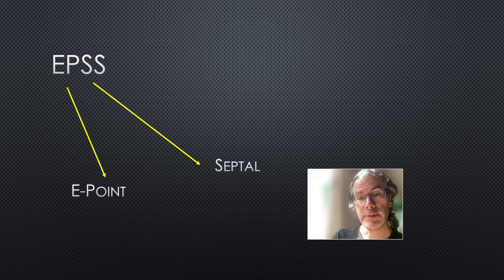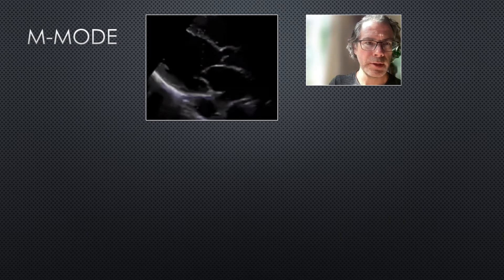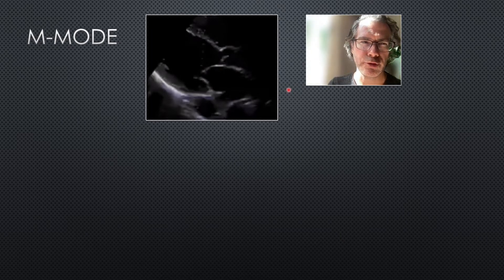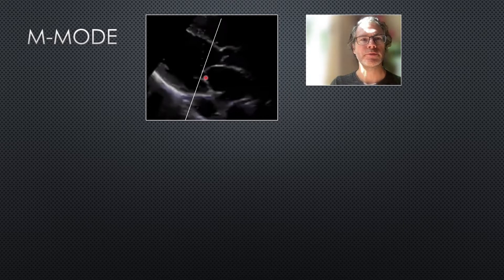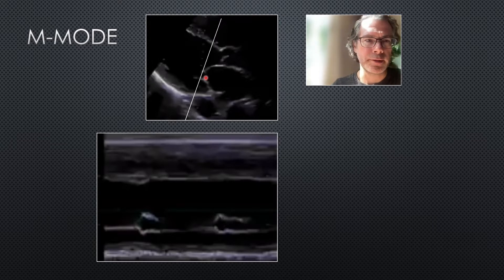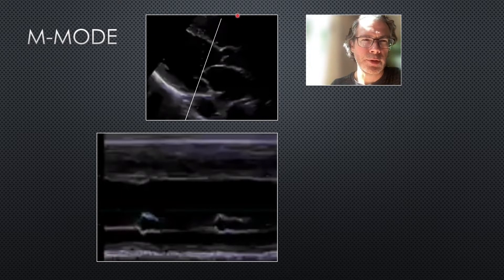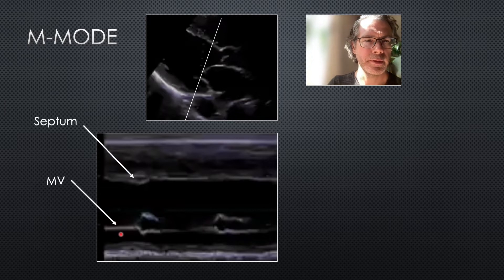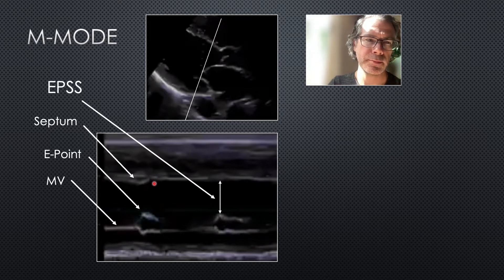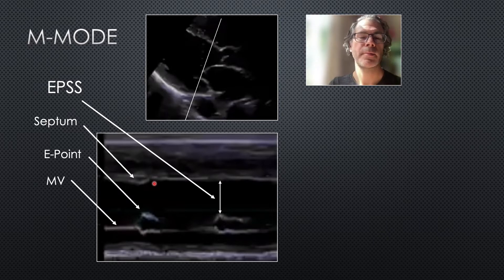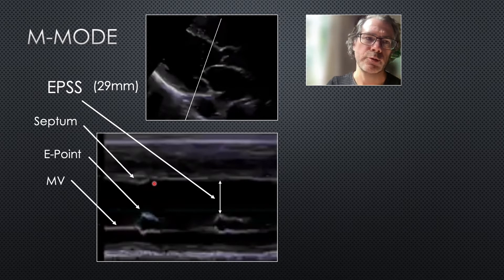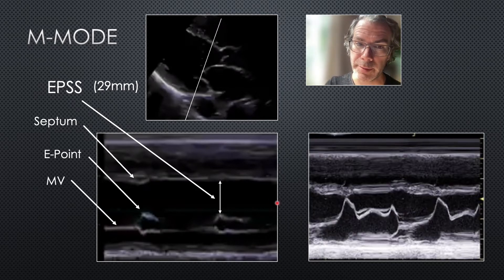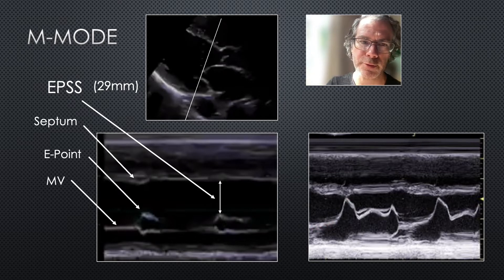EPSS stands for E-point septal separation. To measure it, get a parasternal long axis and drop your M-mode line through the tips of the mitral valve. When you activate M-mode you get a trace: all structures along the M-mode line are plotted on the y-axis against time on the x-axis. Here's the mitral valve, there's the septum, there's the E-point — the closest point the mitral valve gets to the septum. The distance between the E-point and the septum is the EPSS. In this example it's increased at 29 millimeters. Here's a normal EPSS where the mitral valve flicks up and slaps into the septum — no gap at all.